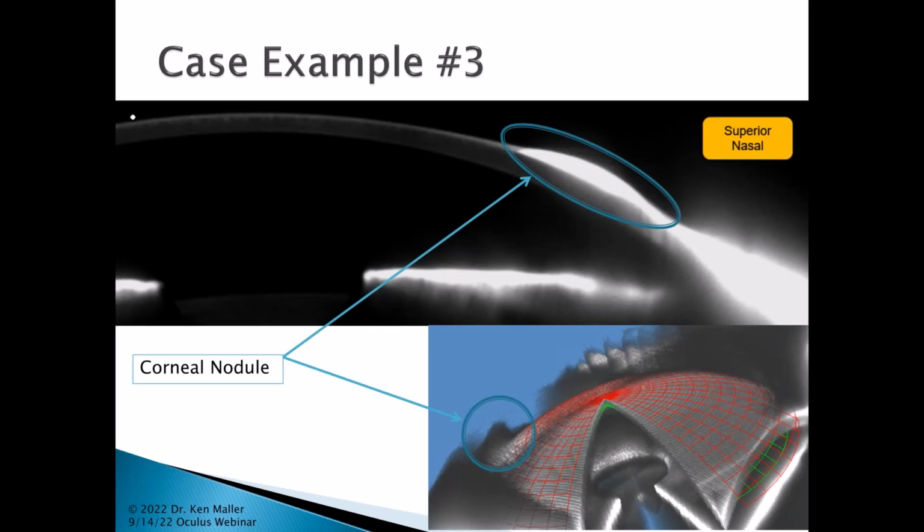And then down at the bottom, I just tried to grab that and I rotated that image around so you can see that shadow that's dead center of that circle. That is actually the nodule that's coming up off the cornea over there at that junction. So it is pretty high, and that more than likely was in part why she had failed with the previous scleral attempts.